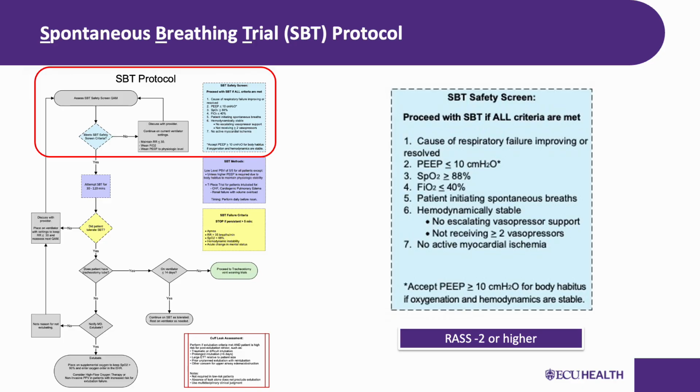a meaningful trial. If the patient has -3 or below, they are not going to be able to participate at all or demonstrate whether they can truly breathe on their own. And the results tell you nothing useful about their readiness for extubation. This is exactly why communicating with nursing before you start that SBT is so important.